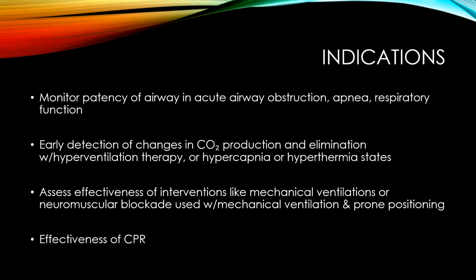So why are we using the end tidal CO2? There are many reasons that we do monitor and look for these values. Because end tidal CO2 provides continuous estimates of alveolar ventilation. Its measurement is useful for monitoring the patient during acute airway obstructions, if they have apnea, if you're weaning them from a ventilator, and endotracheal intubation.